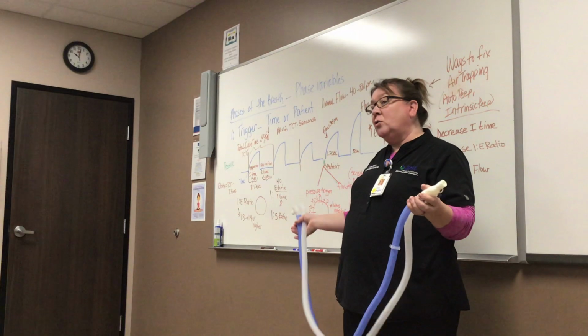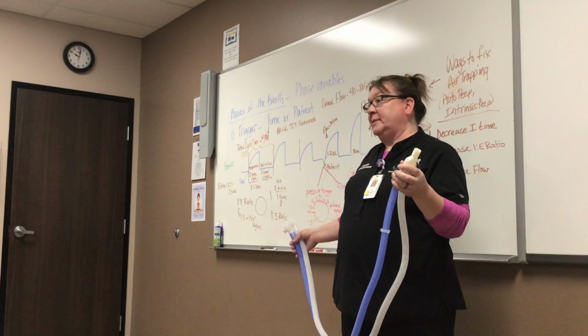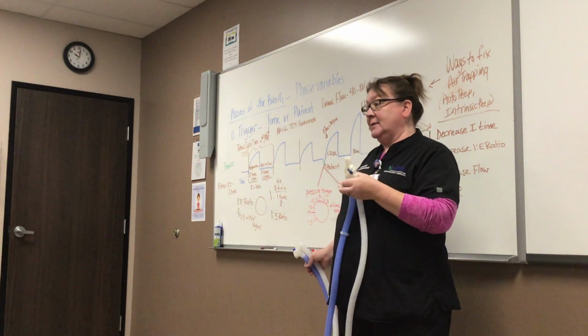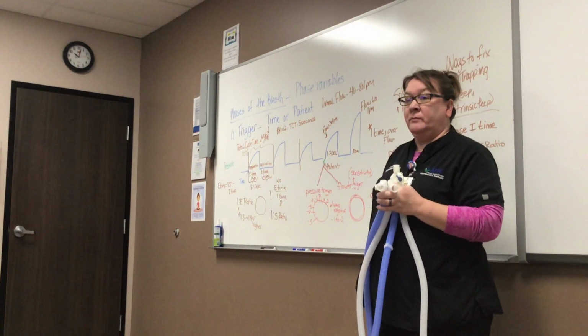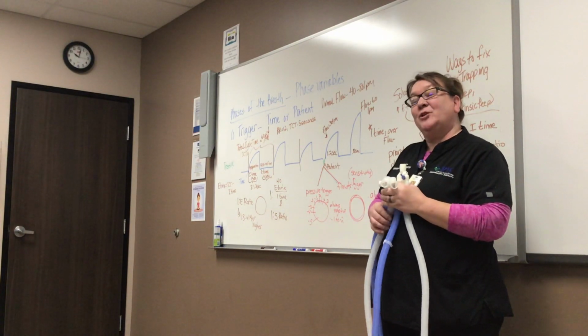It's very old school. Older people, older physicians are probably still stuck on it. But flow trigger is the best and the easiest to trigger and most comfortable for your patient. So flow is preferred over pressure. Let's say flow is favored, so the F's. Flow is favored.